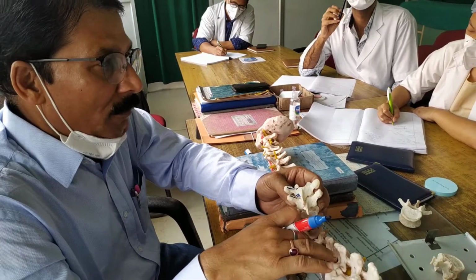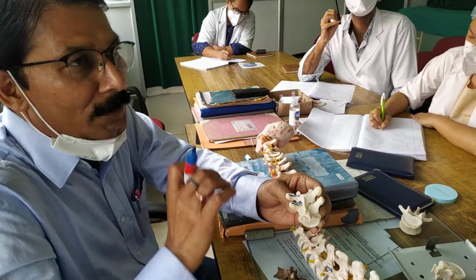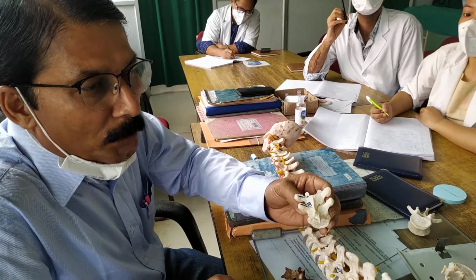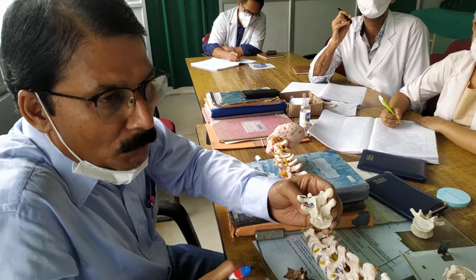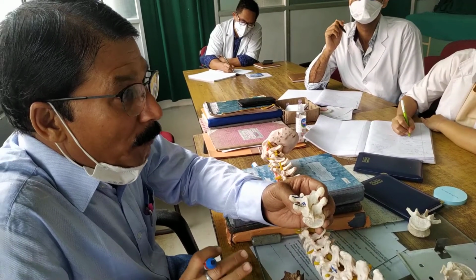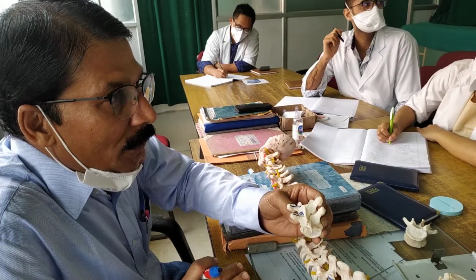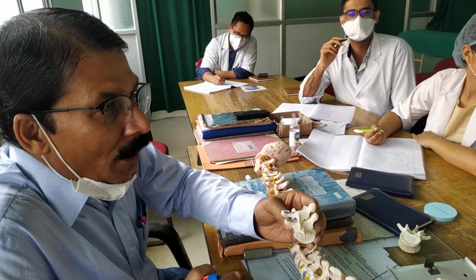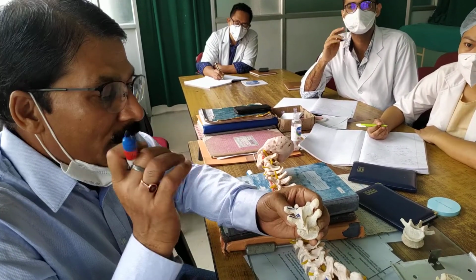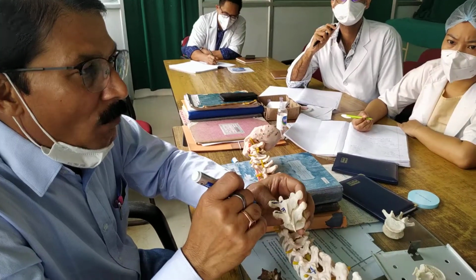But here, not the midline, the upper 1/3 line is more important. Join between the upper 1/3 and the lower 2/3. Extend it medially. Find the midpoint of the superior articular surface. Take a point over there. Then it is the entry point for us. This is the entry point for us.